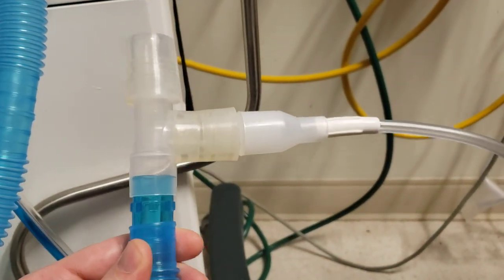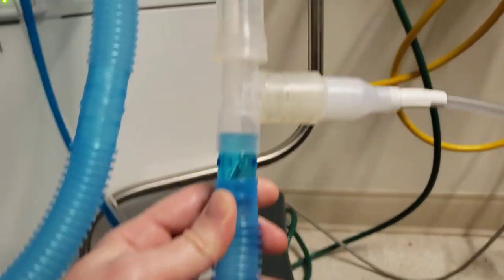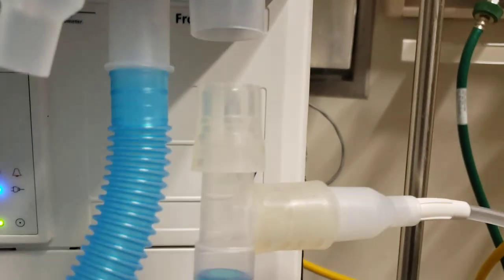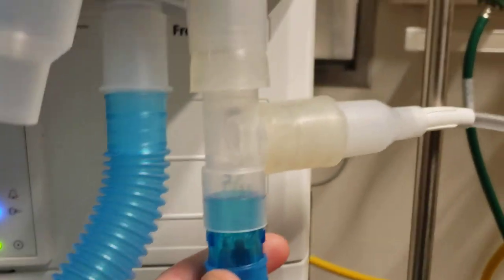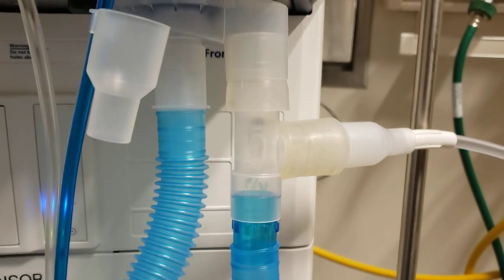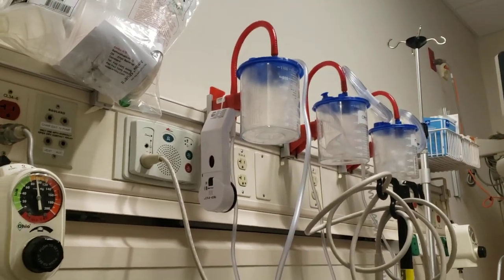I've fabricated a suction scavenging system here that, when placed on the exhalation side of the vent, it pulls out all of the exhaust gas straight up through your standard suction line.